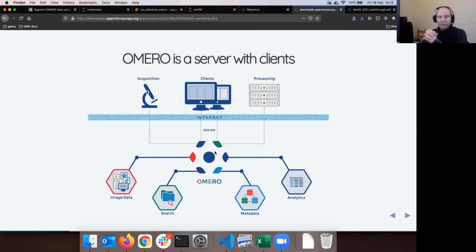It's a software which you have to install on some hardware. And that hardware must be provided in a real world, in the hard world, so to say, to install a software on. The step when you are installing something on a hardware is not a responsibility of the Ome team. It's the responsibility of the hosting institution of this and that Omero server.